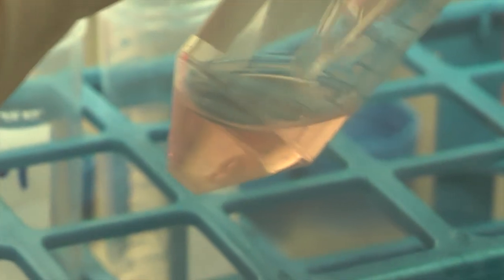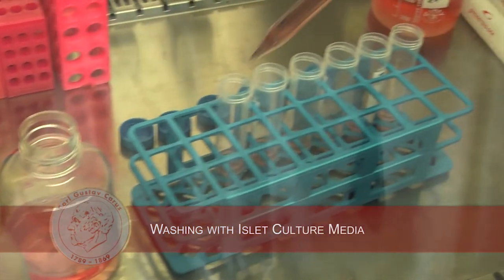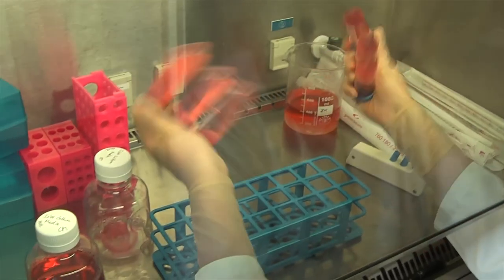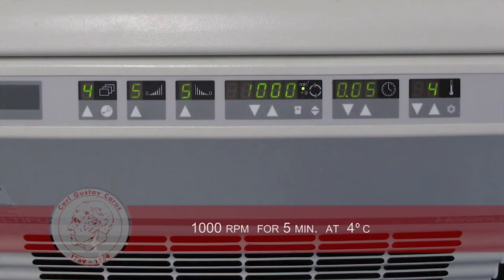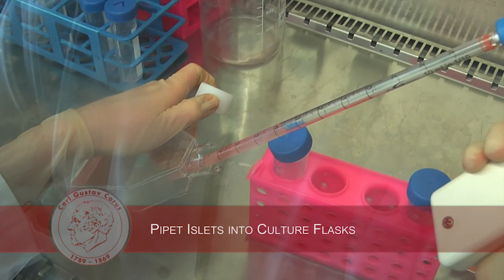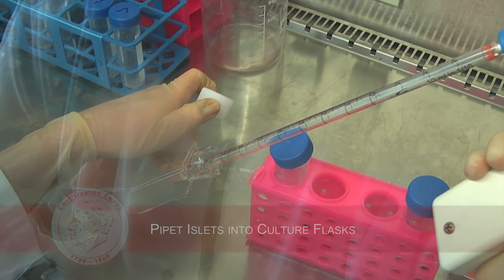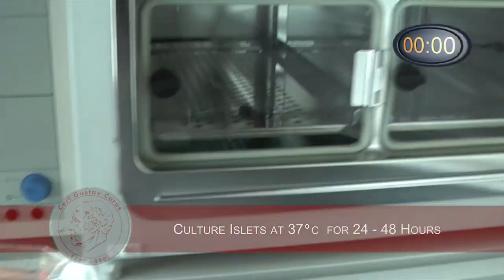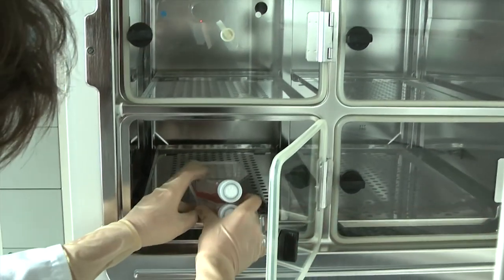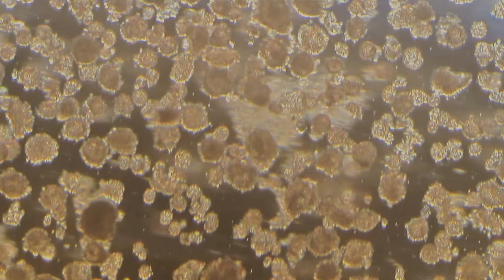We repeat the washing step with islet culture media at 1000 rpm for 5 minutes at 4 degrees Celsius. After this culture step, the islets are ready for further processing.